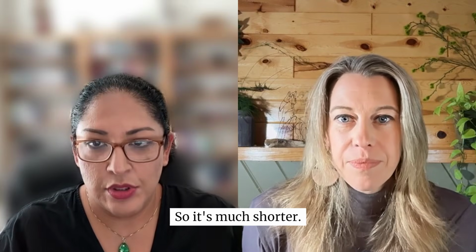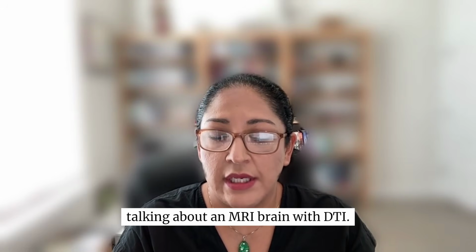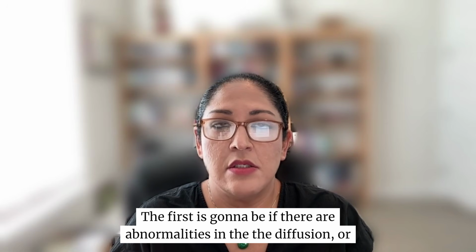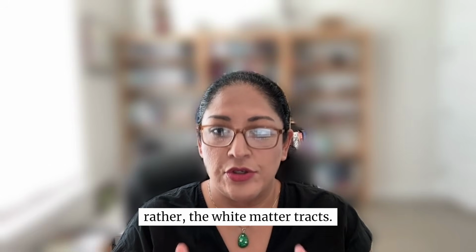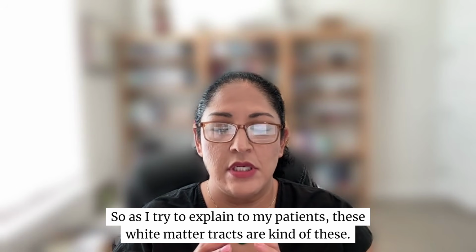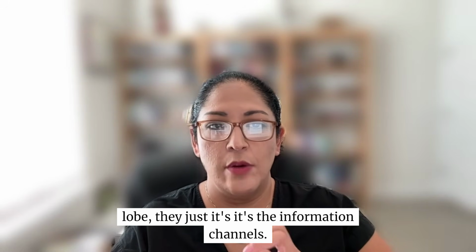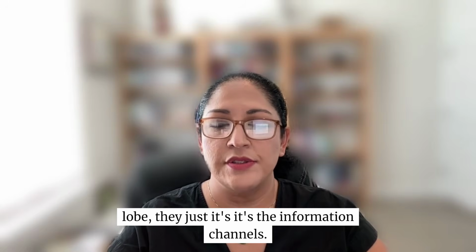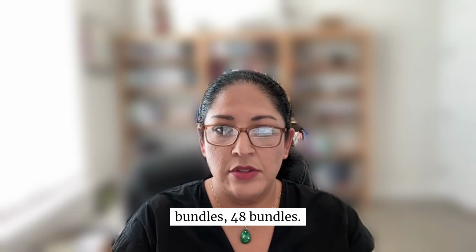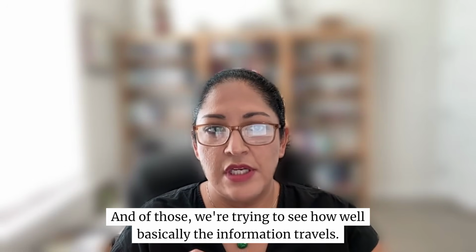So it's much shorter. And there are three things that I'm really looking for when we're talking about an MRI brain with DTI. The first is if there are abnormalities in the diffusion, or rather the white matter tracts. As I try to explain to my patients, these white matter tracts are these connections, like information highways that go between the frontal lobe, occipital lobe. It's the information channels, and the computer program, depending on the strength of the magnet, will look at 33 bundles, 48 bundles. And of those, we're trying to see how well the information travels.